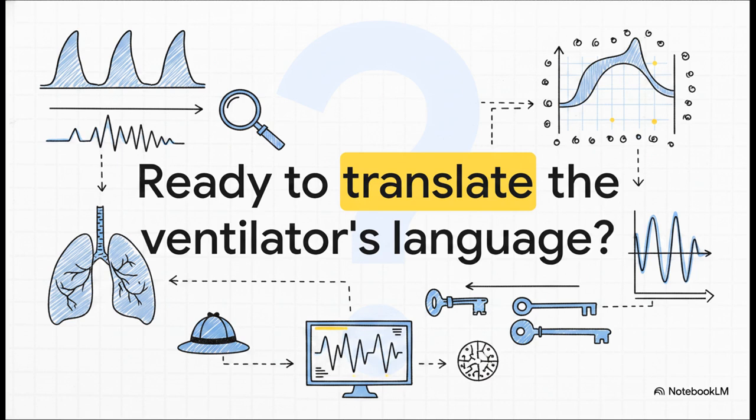Keep this explainer handy, but before we go, it begs a much larger question. As medical technology continues to advance, what other subtle, hidden languages are the machines in your hospital speaking right now, just waiting for you to translate them?